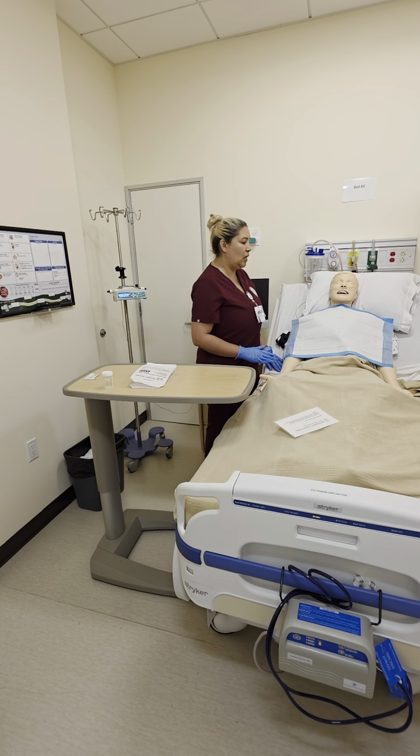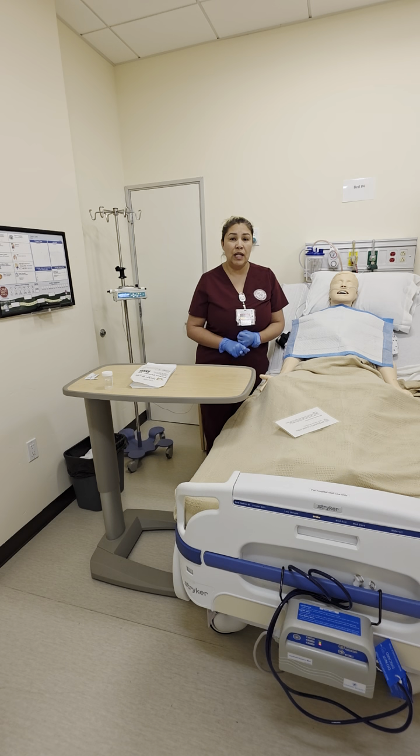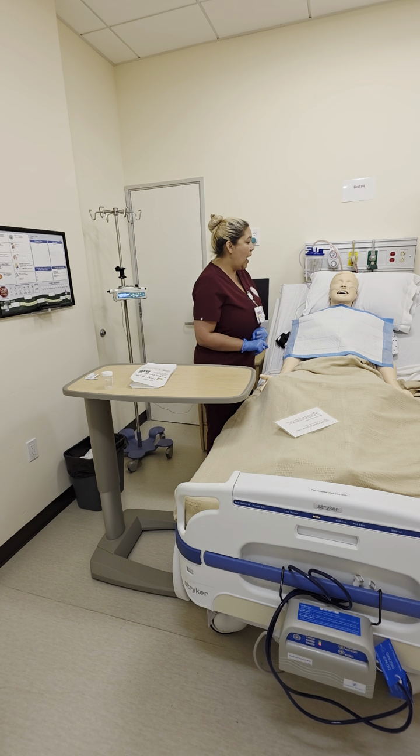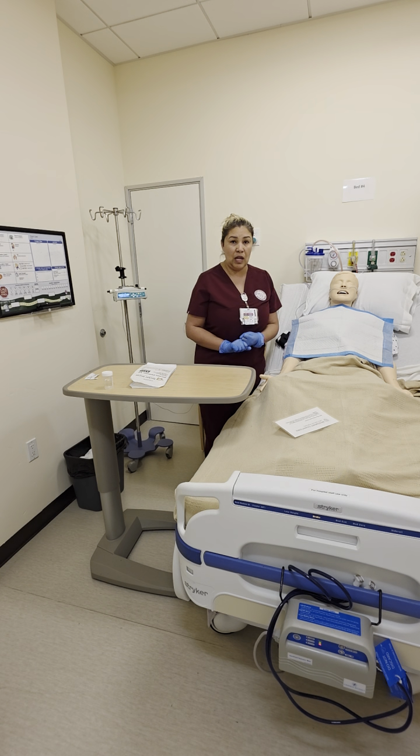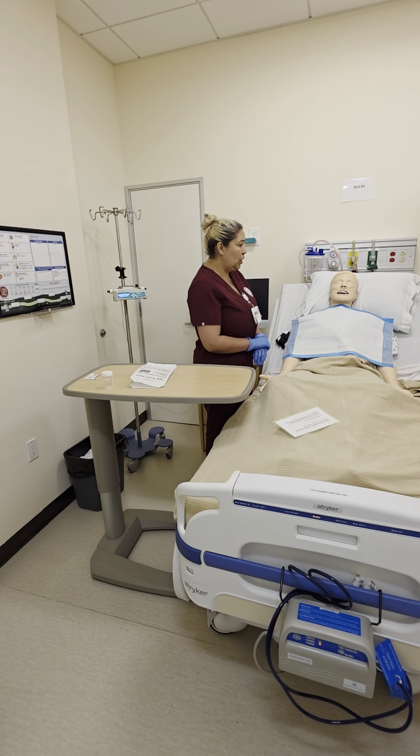Before I have done all this, I would have already auscultated my patient's lungs. I would have performed vital signs. I already put the pulse oximeter on my patient's finger, and I'm keeping it on throughout the procedure to make sure that his oxygen levels are not too low.